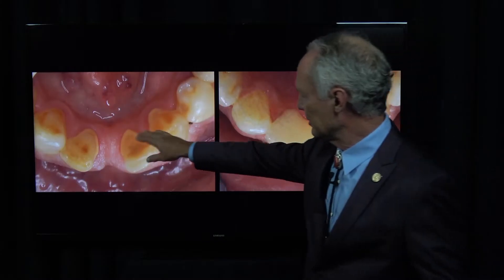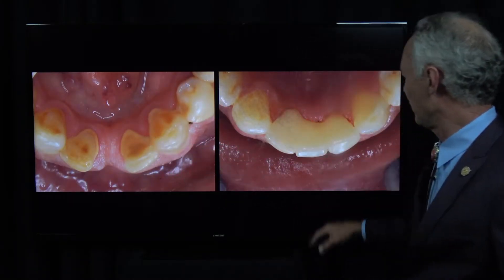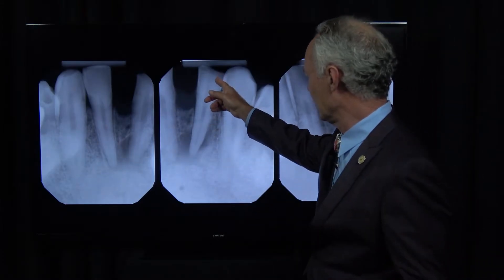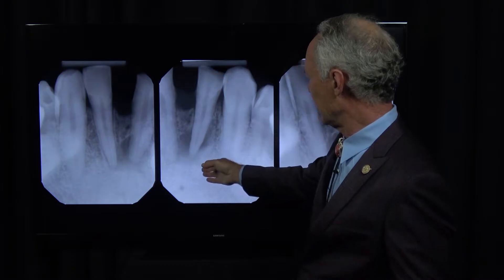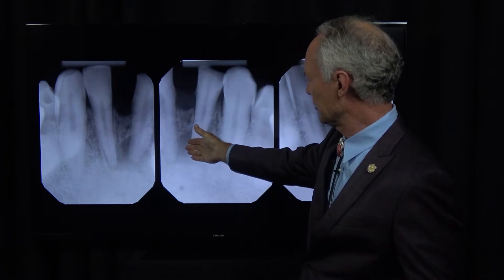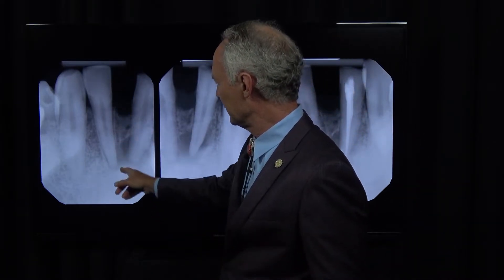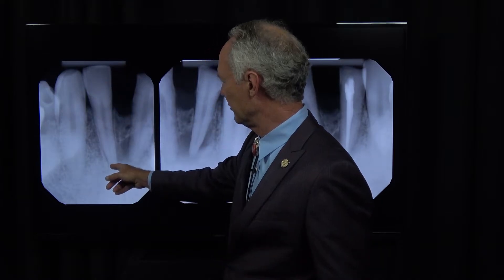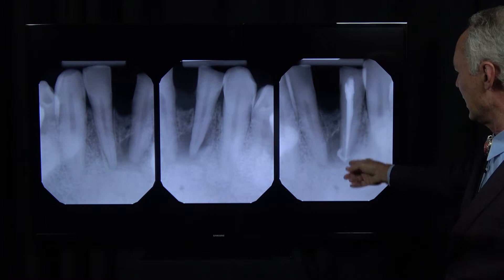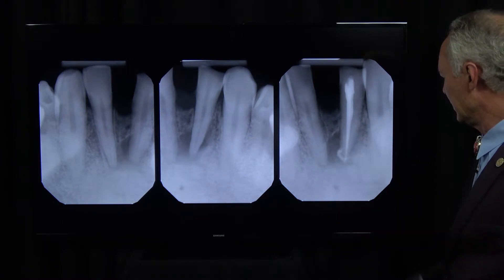You can see this patient needs a good cleaning and is missing a tooth - this is the before and after. This was a tricky case. The lower left lateral incisor was abscessed and the lower left central incisor was missing. So here's the lower left lateral, lower left central, lower right central - and it was fine. The first thing we had to do was perform endodontics on the lower left lateral to clear up that infection.